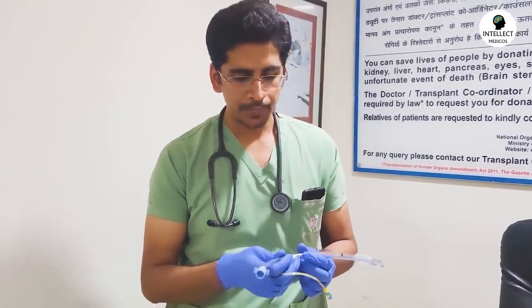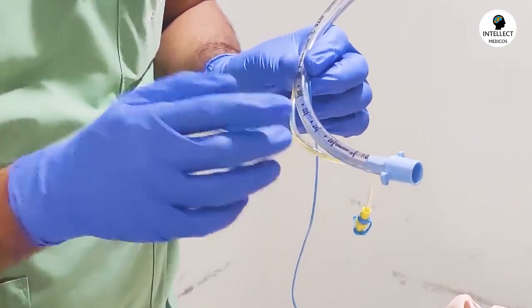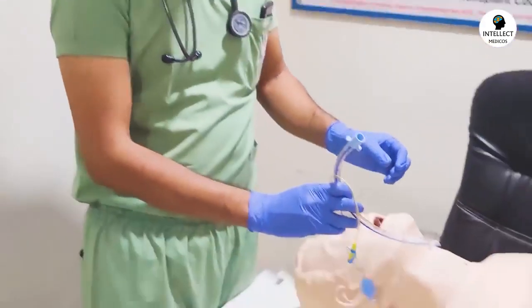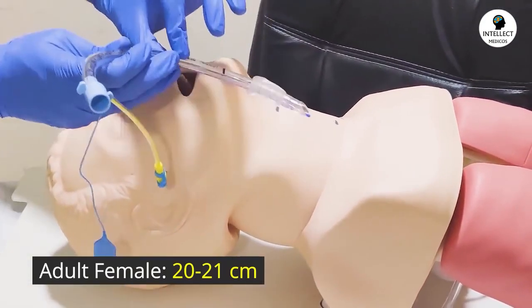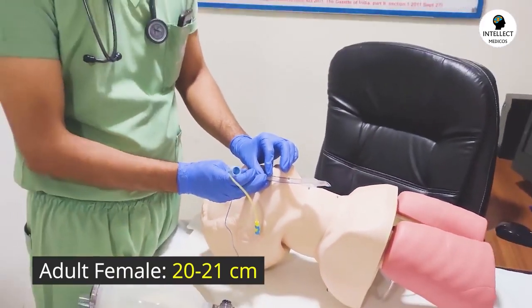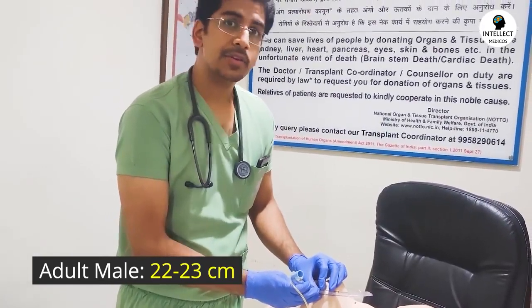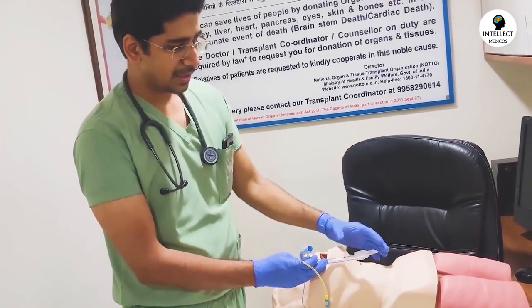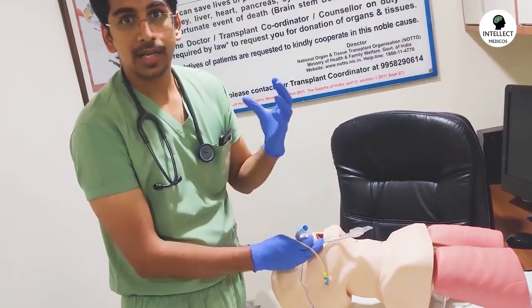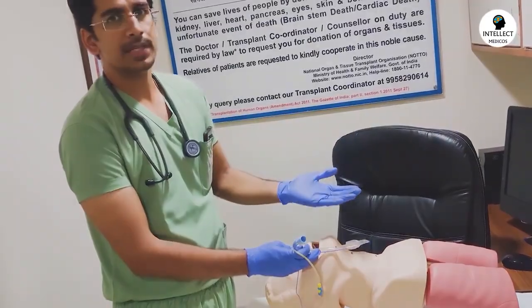Now talking about the depth, how much you need to insert this endotracheal tube. There are various marks as we discussed: 18, 20, 22, 24, 26. Then, when you are inside the trachea of a patient, in an adult female we prefer to fix at the angle of the mouth around 20 to 21 centimeters, whereas for an adult male we prefer to fix at 22 to 23 centimeters. That depends again on the patient profile. If there is a short neck, then the depth to be inserted is on the lower side. So that depends on the patient again.